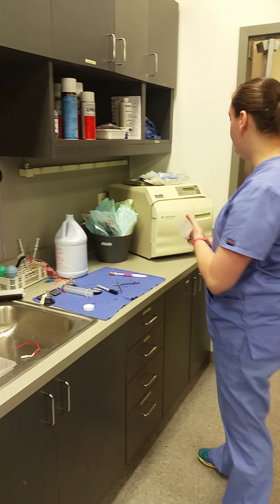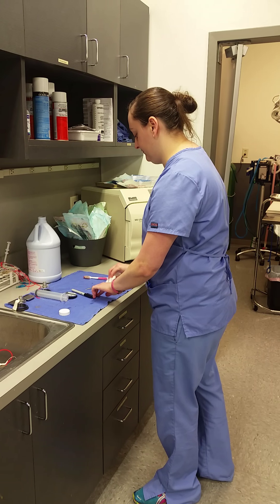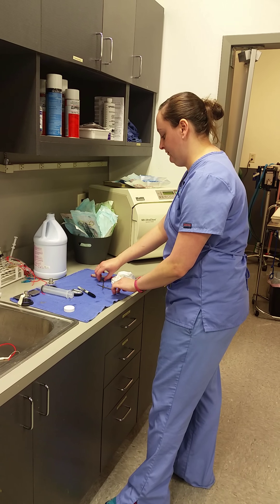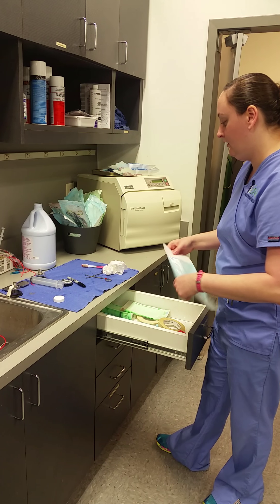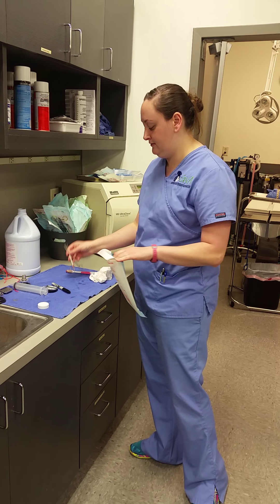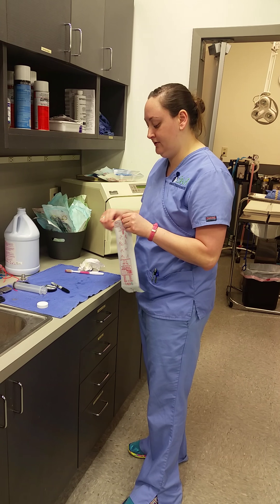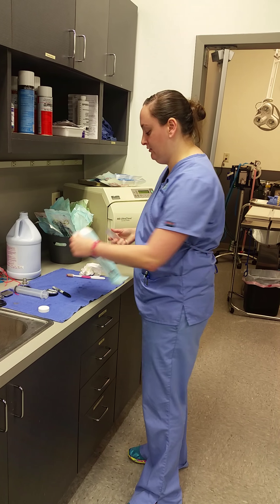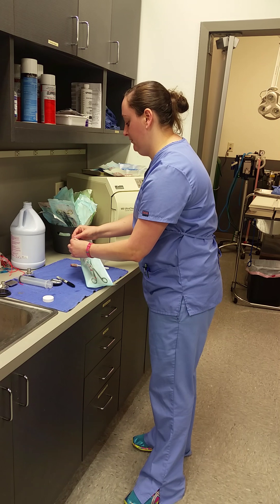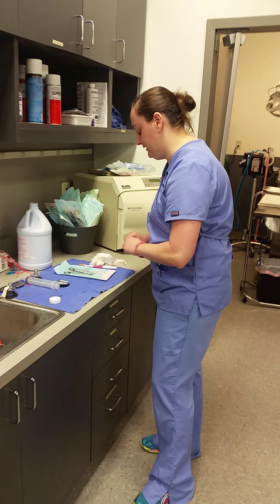Once it is dry — we're going to kind of speed up the process here — so once it's dry, you use one of these little autoclave pouches for a small instrument. These are great because they have a sterility strip inside. We'll close the pouch and write the name of the instrument and the date on it.